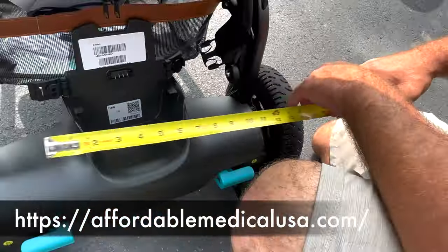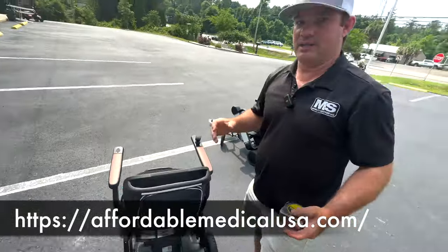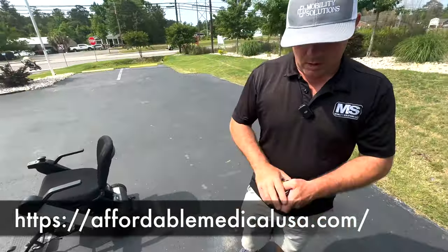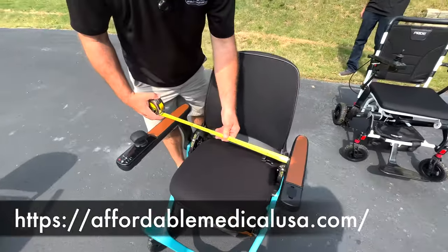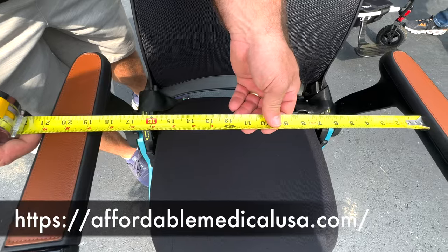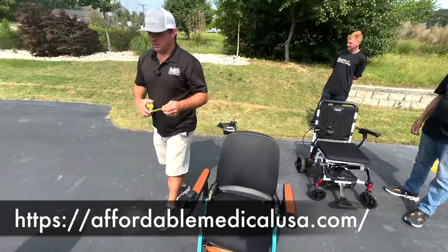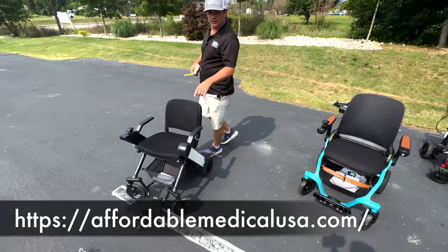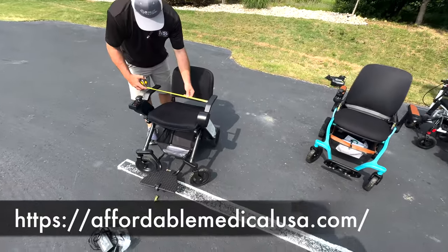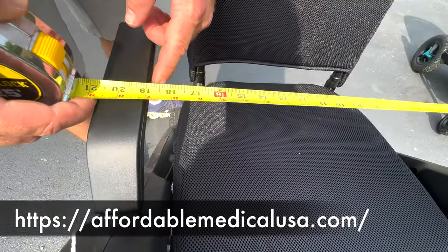So that's a big deal, guys. You might love this chair, but if you can't get it through your doorways, if you have small doorways, it might have to be something like that. But I will say, between the arms on this one's almost 19 inches, 18 and a half. This one's 325 pounds. This one, I believe, is, let's say 275, I forgot. That's surprising a little bit. That's 19.